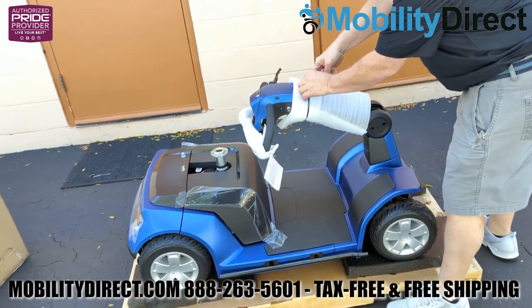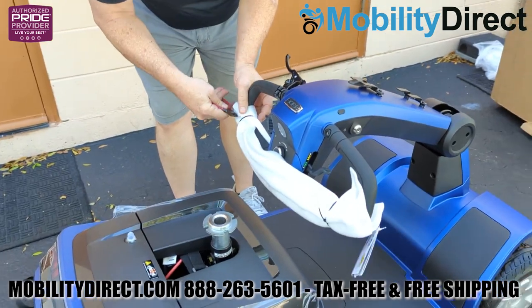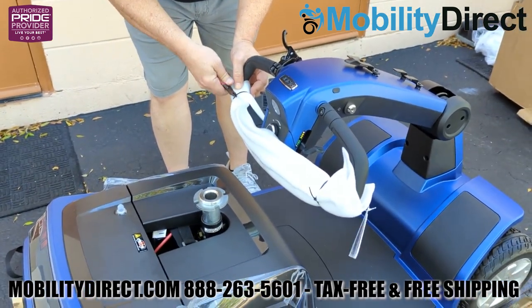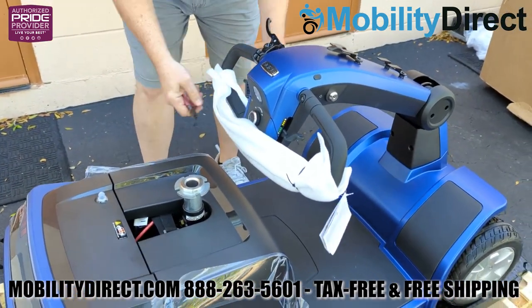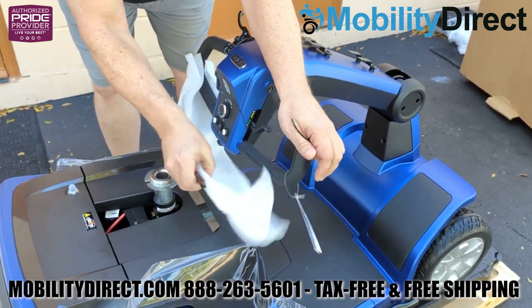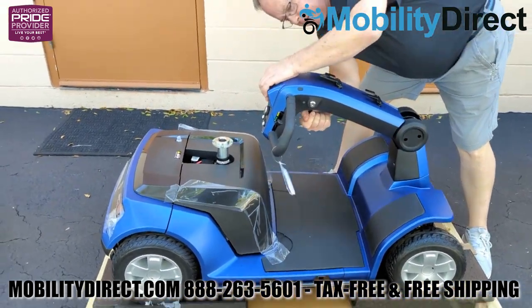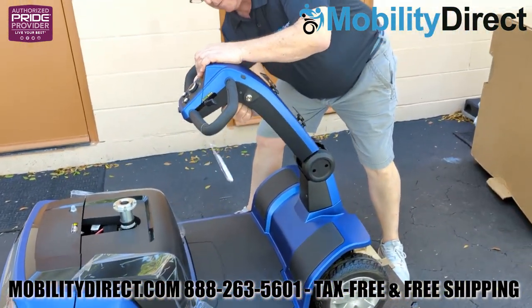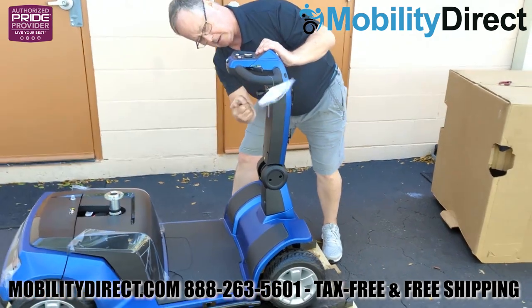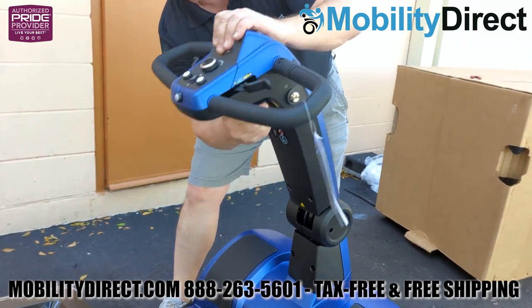Next, go ahead and cut the zip ties that are holding the Styrofoam protective sheeting around the front of the scooter, both on the steering column and on the handlebars themselves. Go ahead and remove that, and be sure to keep all of your packaging for at least five days in case you need to return your product.